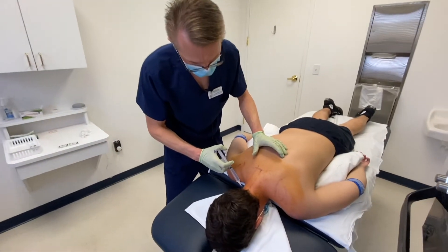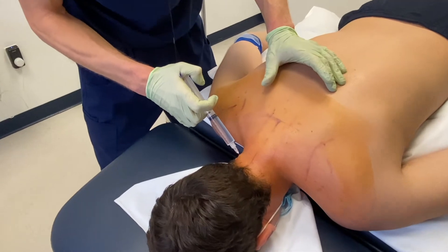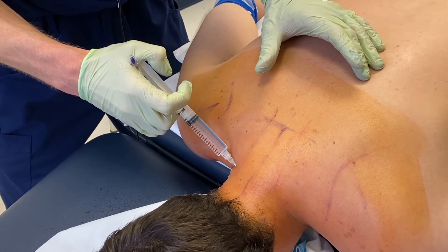What I'm going to do next is anesthetize the area — just a little poke right here. This is a little bit of lidocaine and ropivacaine, and this will help the procedure be less uncomfortable.